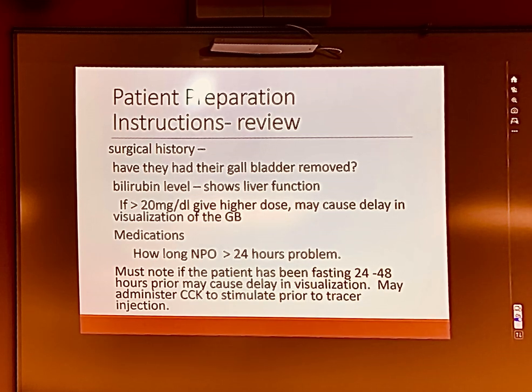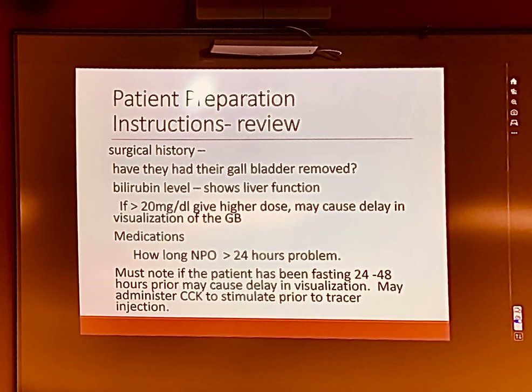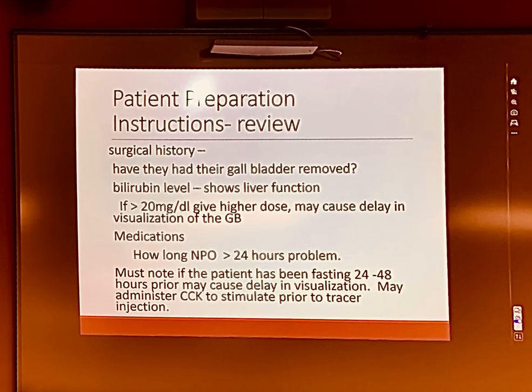So again, when you get your patient, you're gonna ask them, have you had your gallbladder removed? You're gonna check their bilirubin and their liver function tests, okay? You're gonna check their medications. What medications are they on? The only medications we care about for a HIDA are opiate pain medicines. We don't care about anything else. Okay. If the patient has been fasting for more than 24 to 48 hours, you're gonna reach out to your radiologist to see what exactly they want you to do.